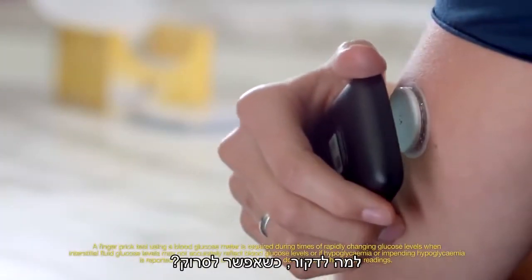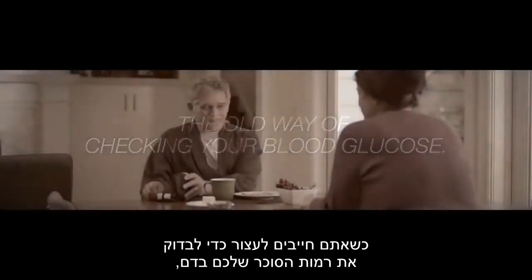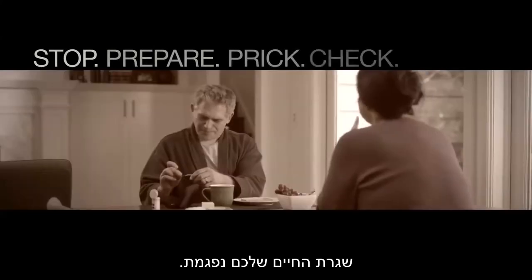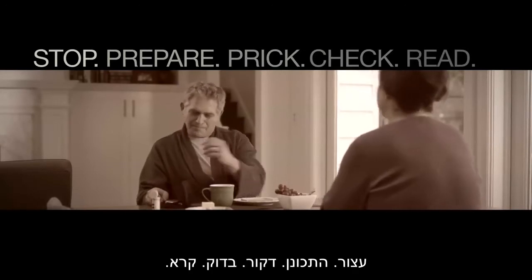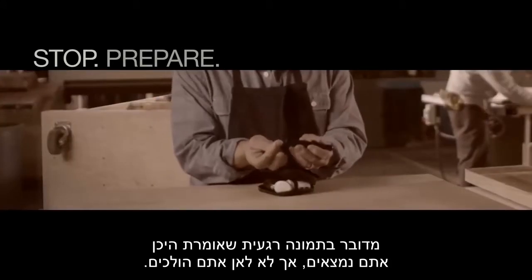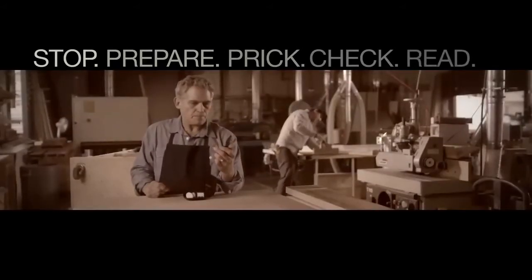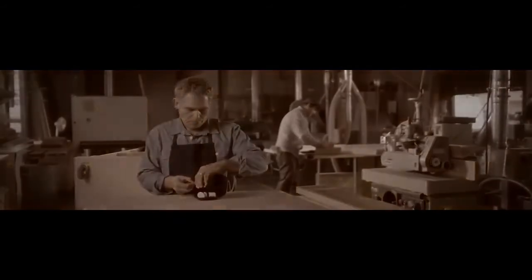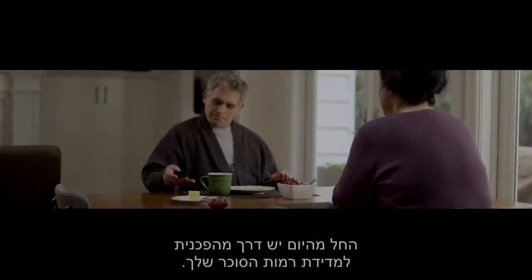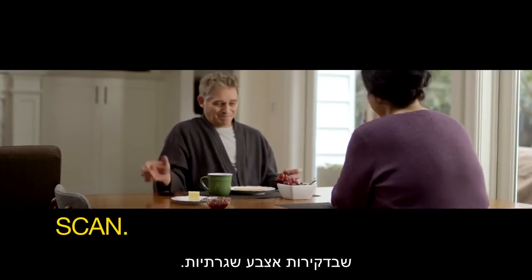The Freestyle Libre system — why prick when you can scan? When you have to stop to check your blood glucose the old way by pricking your finger, life gets interrupted and you only get a glucose number and nothing more. A snapshot that tells you where you are but not where you're going. Starting today, there's a revolutionary way to check your glucose with a quick scan and without the pain, hassles, and interruptions of routine finger pricks.